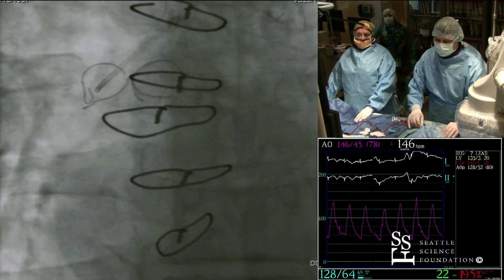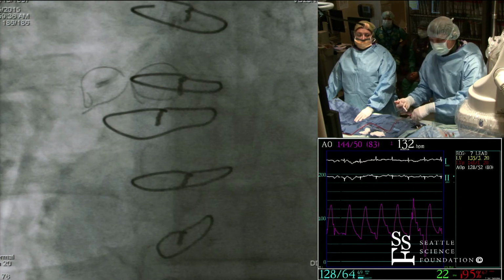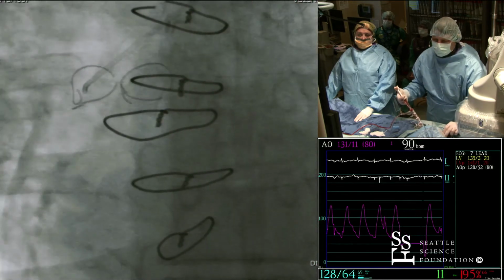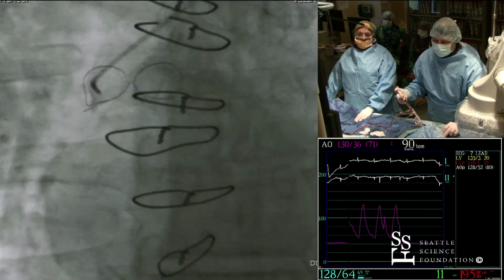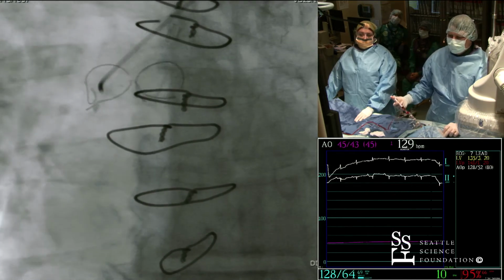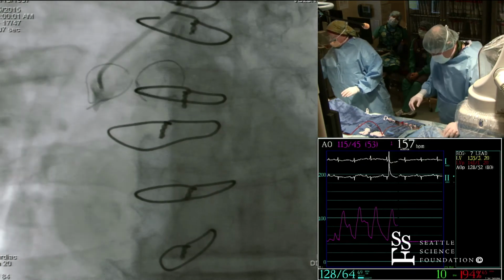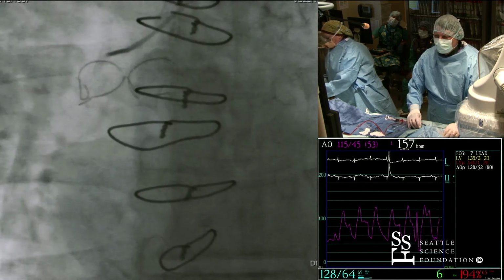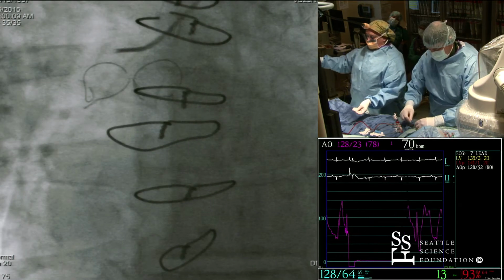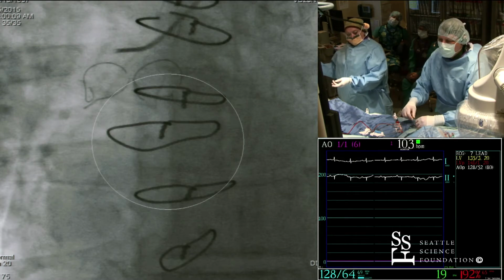No, we do the brachial vein. I think you have a lecture on right arm for the right heart cath, and it's much better. I challenge my fellows to do the complete right heart cath with less than 15 seconds of fluoro. The nice thing about it is the Swan wants to go into the pulmonary artery from the right arm. Then we change out for the JL. It's really pretty good. Or we'll do both from the right arm. The one we're going to do this afternoon, we're going to do both from the right arm.